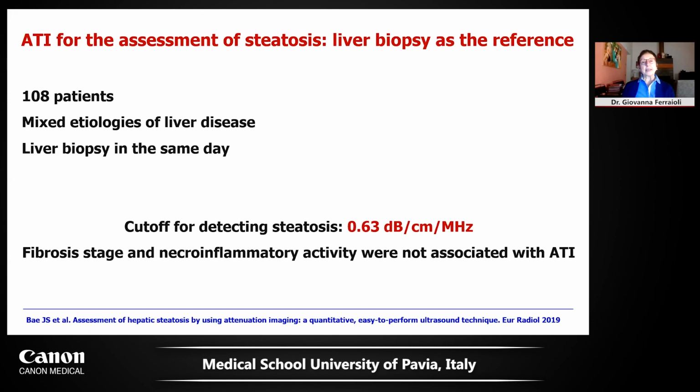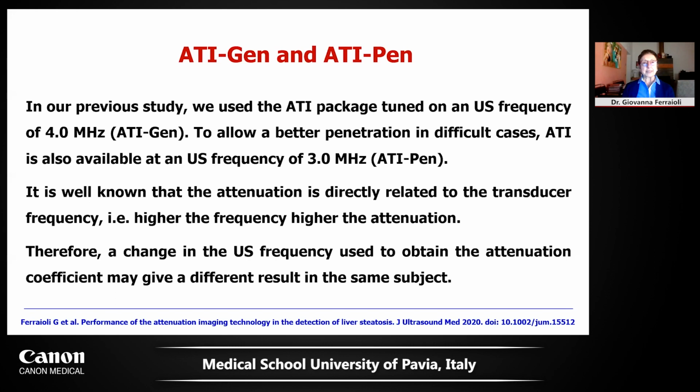And interestingly, in a study performed using liver biopsy as the reference standard, the cutoff for detecting steatosis was similar to the one we found in our study. And in this study, fibrosis and necroinflammatory activity were not associated with ATI. So fibrosis is not affecting ATI results.